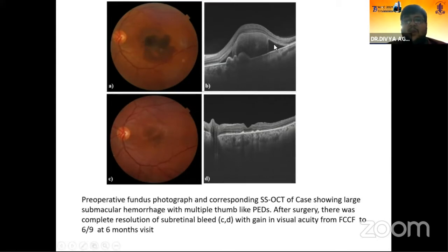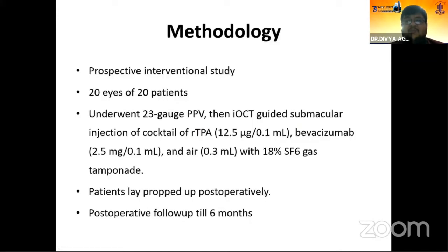This was the pre-op image of one of the patients with a large submacular hemorrhage. Post-operatively, the submacular bleed got resolved and his vision improved from finger counting close to face to 6/9 at the six-month visit.